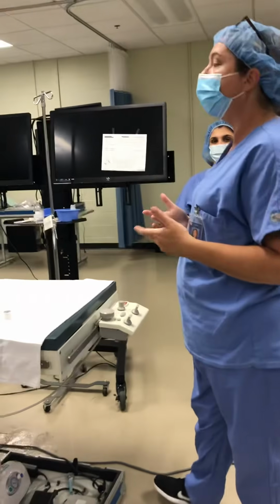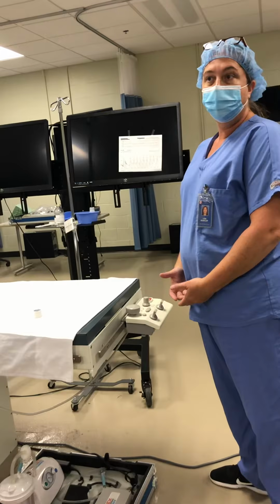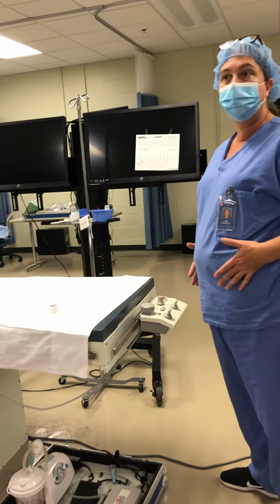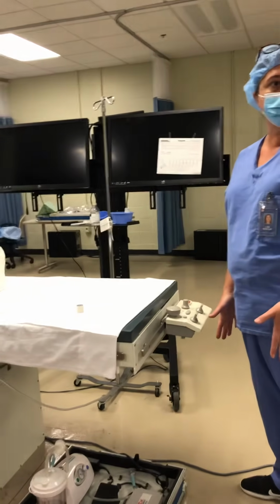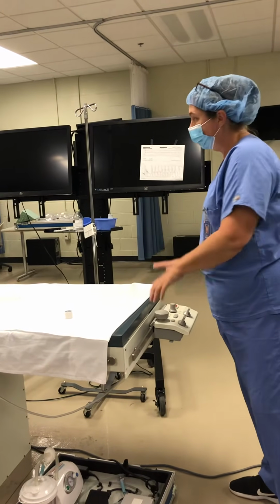And then we didn't make it there today, but the abdominal angiogram for the bifurcation and for the runoffs, when we do the pictures of the legs, okay? Super simple. Should be. Better be.